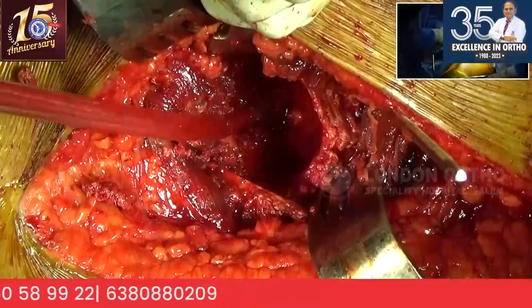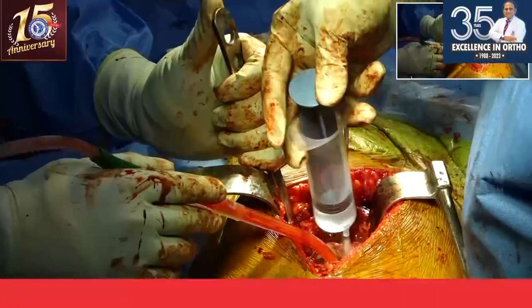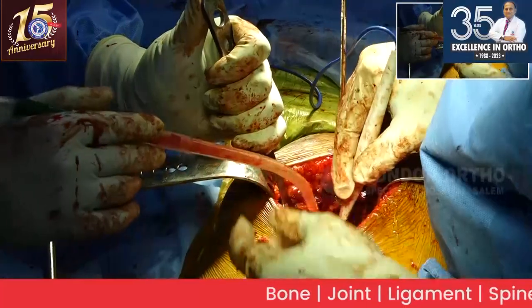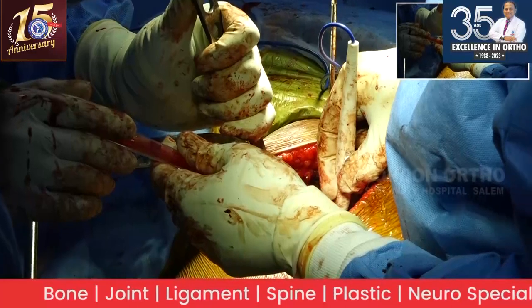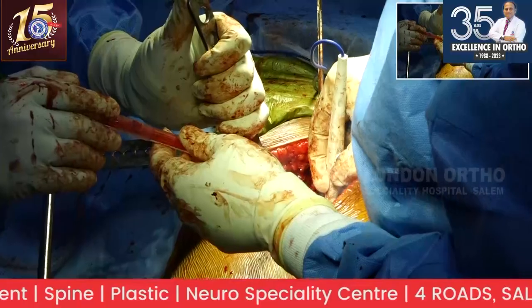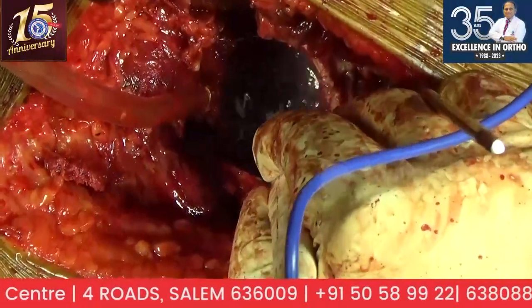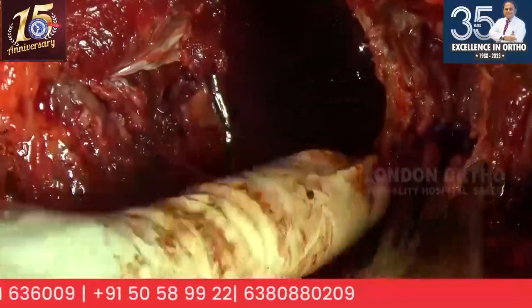Wash kudupa. 48 cup, screws pullum, and bone graftum. Can it be reamed a little bit more and deepened? Can it be deepened a little bit more with 46 and then push it a little bit? Because it looks 1 or 2 millimeters. There is osteophyte also. The cup is still seen. So, can we ream a little bit more with 46 and then push it in, deepen it, so that the capture will be a little better?